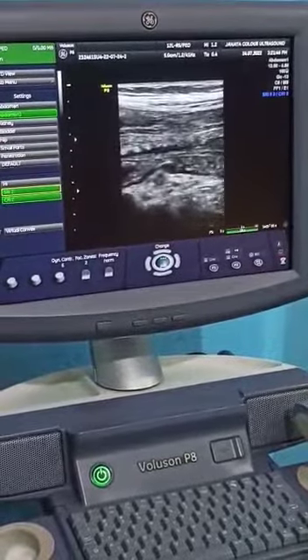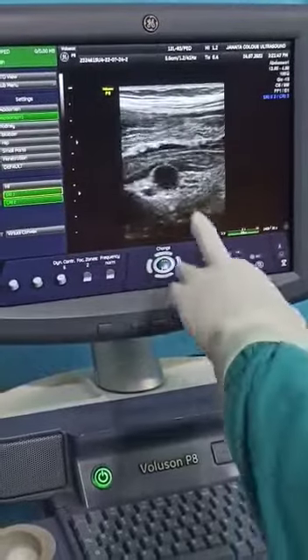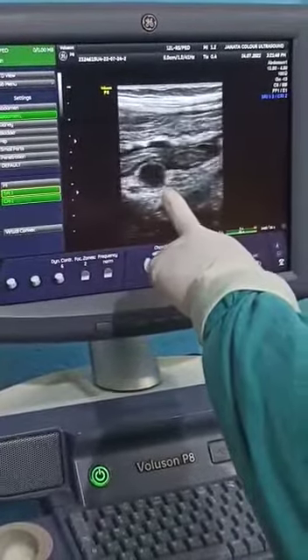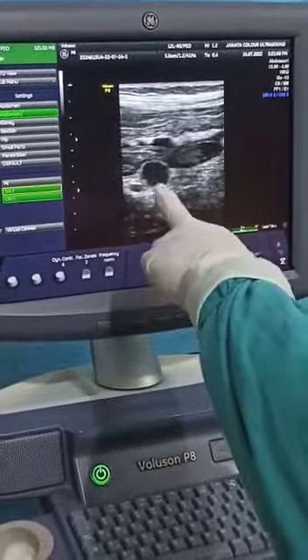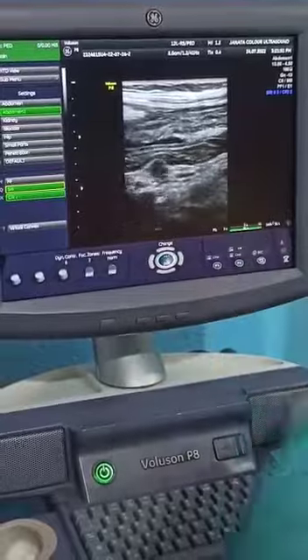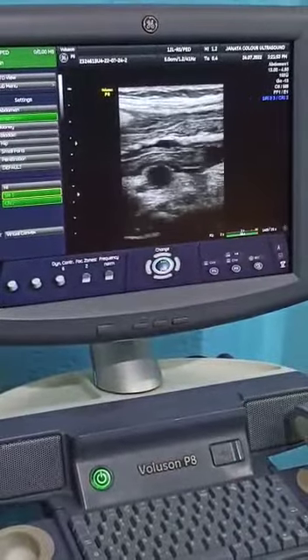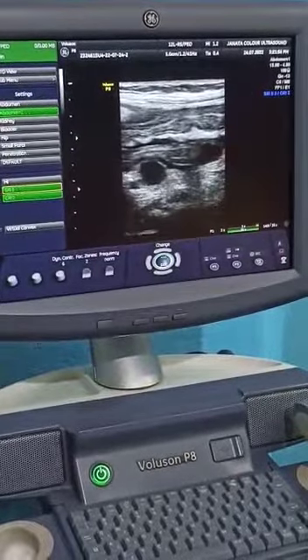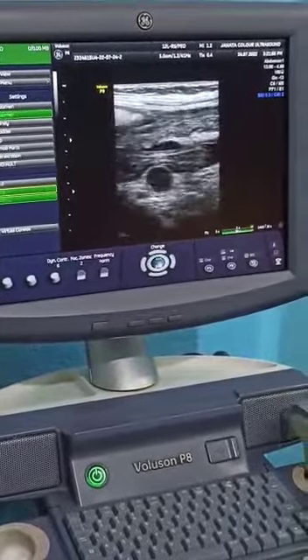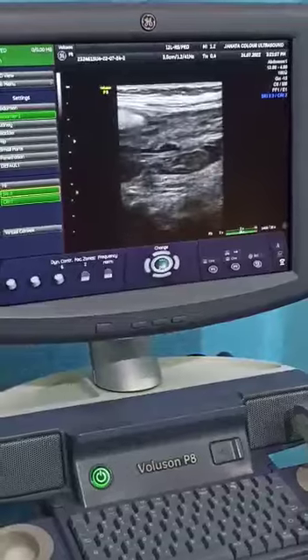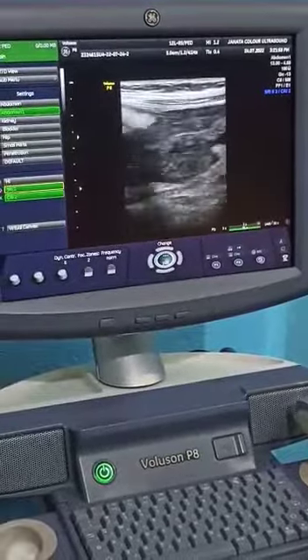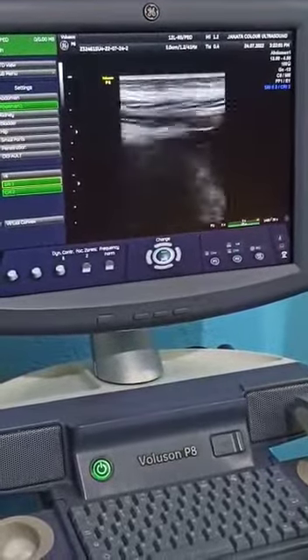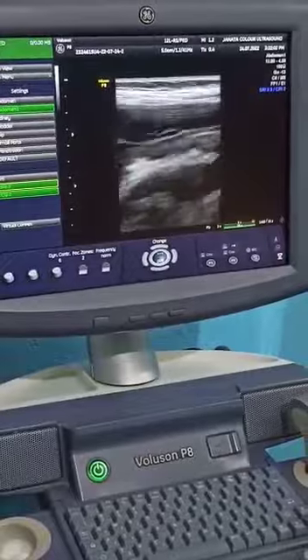One thing I would like to show: this is a mesenteric lymph node. You are noticing this hypoechoic area is the lymph node. Multiple mesenteric lymph nodes are there.